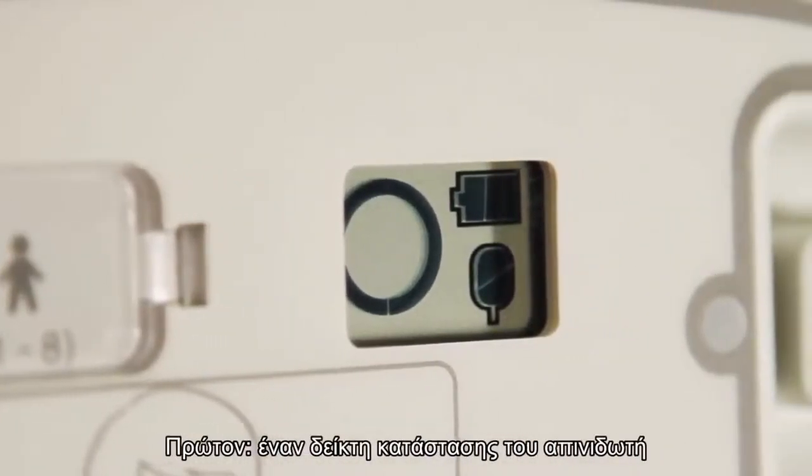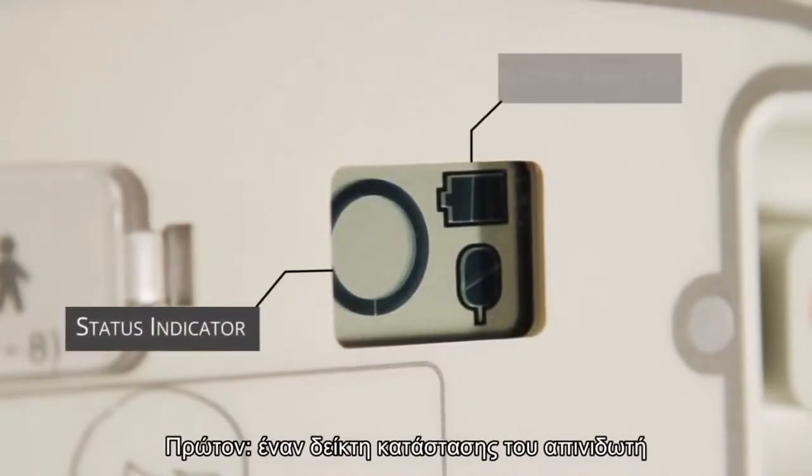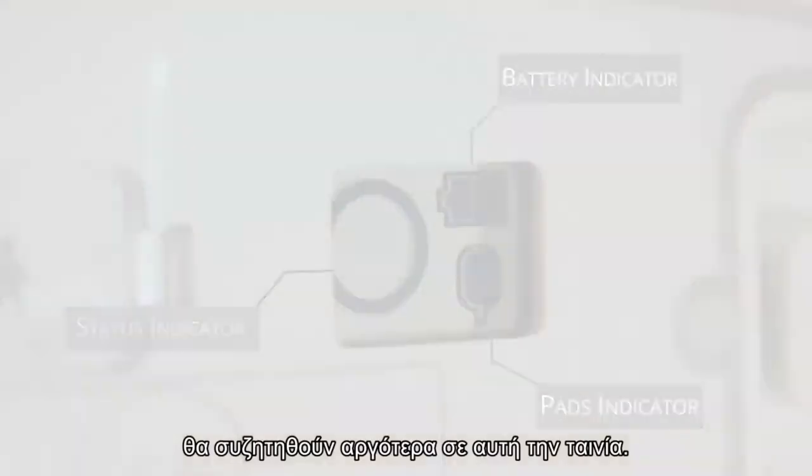This window should show three key things: one, a status indicator; two, a full battery indicator; three, a full pads indicator. How to fully check your AED will be discussed later in this film.